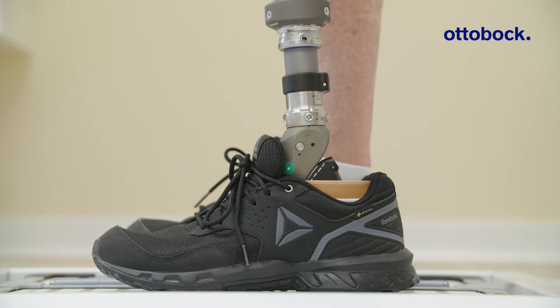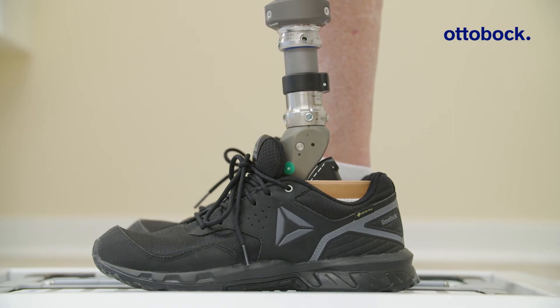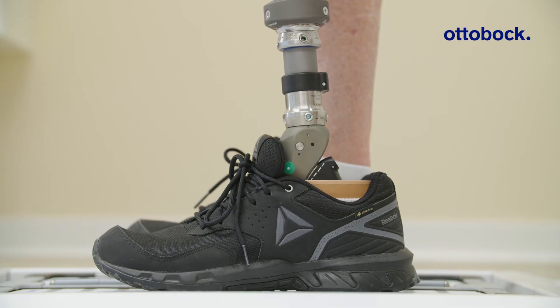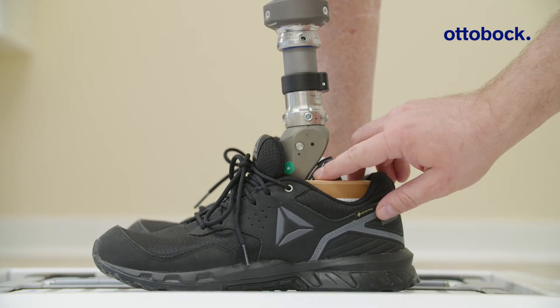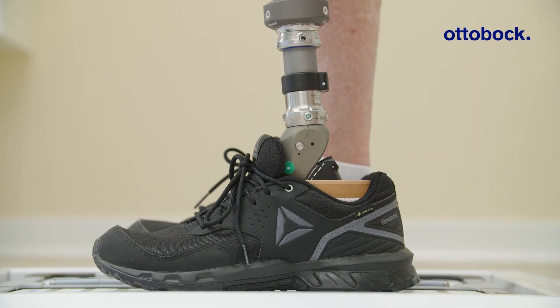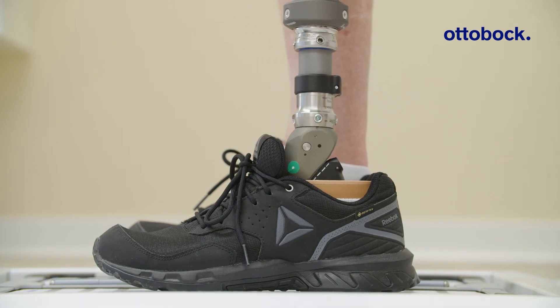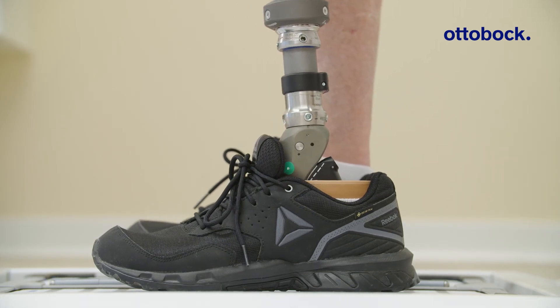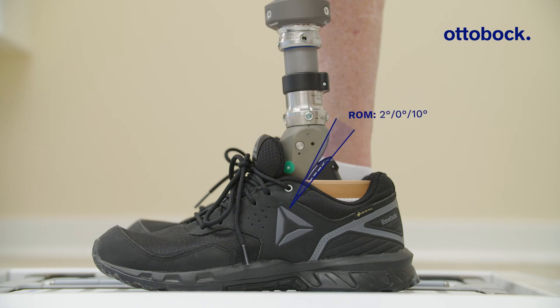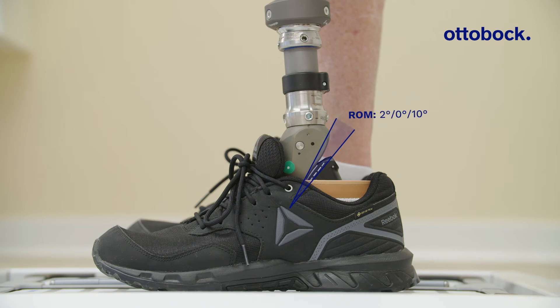Now the user is in a balanced position, landing directly on the neutral ankle position displayed by the solid line. Double check if balance can be found again after rocking back and forth. The solid line indicates a range of motion from 2 degrees of dorsiflexion to 10 degrees of plantar flexion.